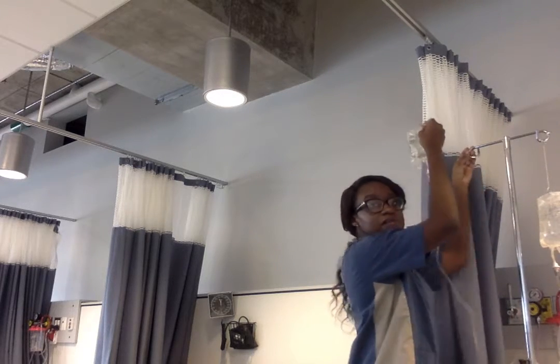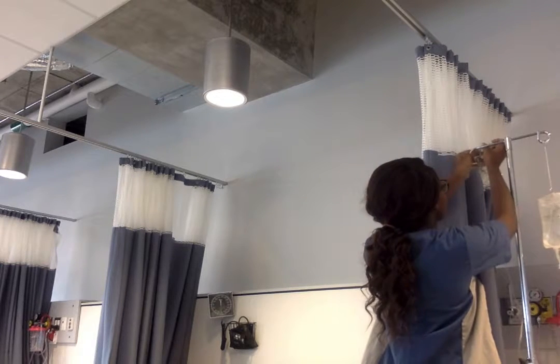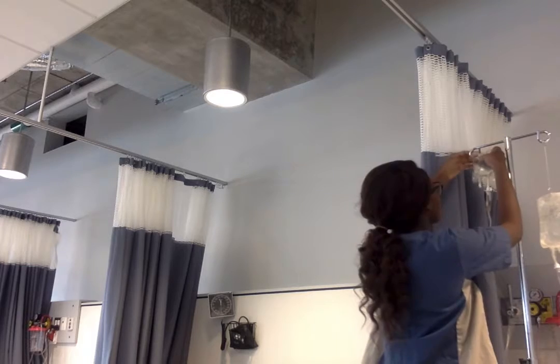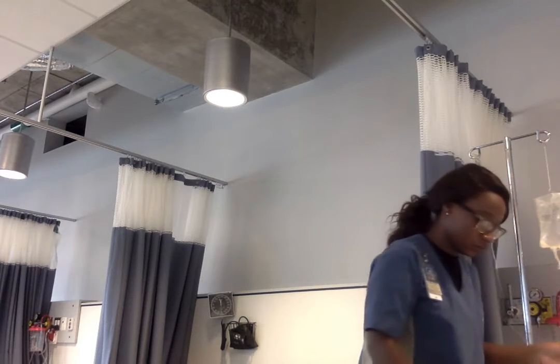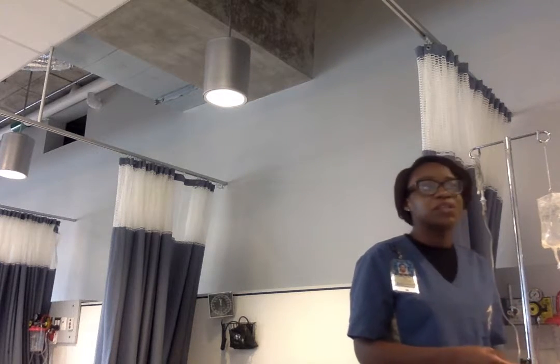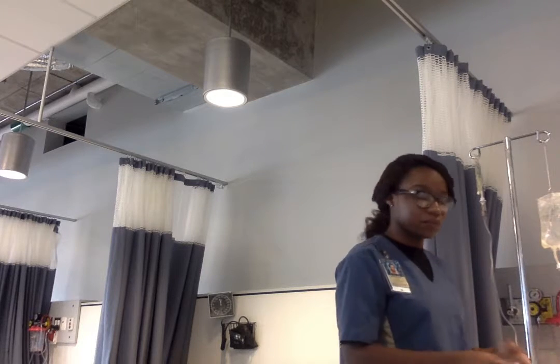I'm just going to raise my bag. So now that I know my drip rate, my infusion rates, I'm also going to be doing that. So I'm going to be watching this one, making sure that I can get 2 drops every 15 seconds.